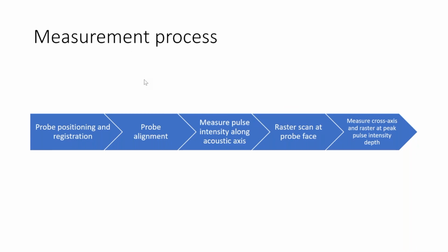We do have another question. Many manufacturers won't even let you go to 1.9, limits to 1.3, 1.4, no matter how much you turn the power knob. And why is that? I believe most manufacturers tend to be a little bit conservative relative to the limits, and sometimes technically it's just not practical to go to levels that are higher than 1.3 or 1.4, given the limits of the hardware that generates the signal.